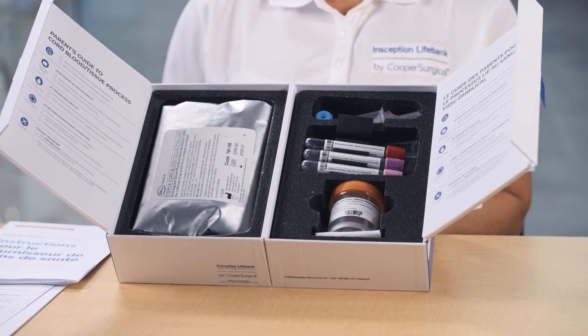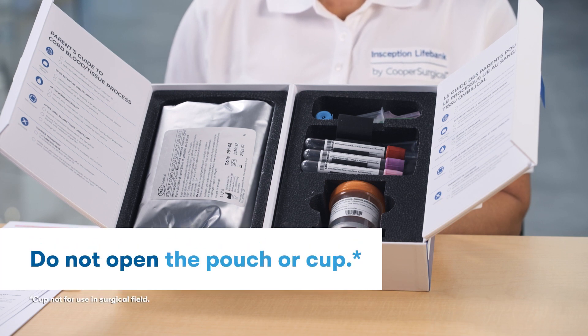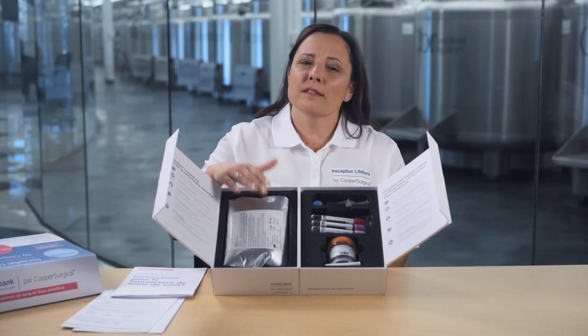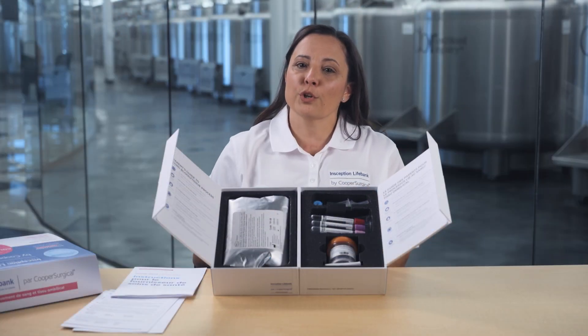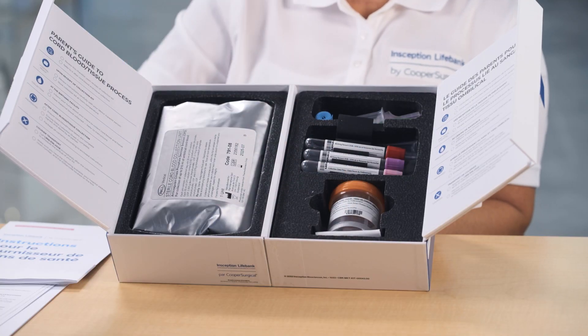Behind the instructions are the materials for cord blood and cord tissue collection. These are sterile, so please don't open either of the items. This is the pouch that your doctor will use for your cord blood collection, and this is the collection cup for cord tissue.